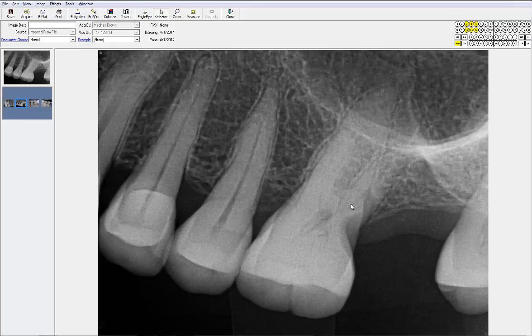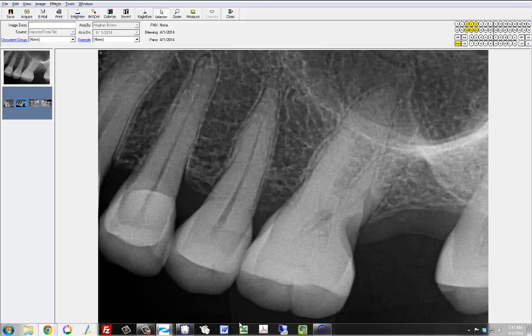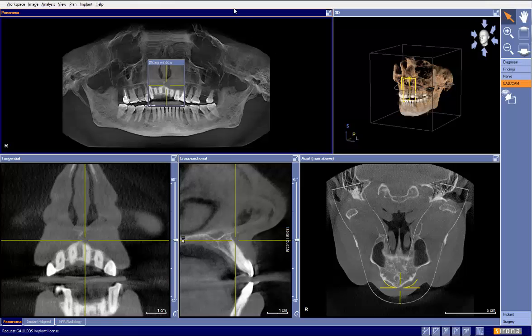We've determined that the best thing in this case would be to go ahead and deem the tooth non-restorable and then go with removing the tooth and looking at an immediate implant placement. So what I want to do in this case is walk through our plan for number 14, determine if we want to do a plan at number 15, and determine if we can do a tooth on number 14, and how we bring everything together and how we order our surgical guide. So let's go ahead and begin on this case.